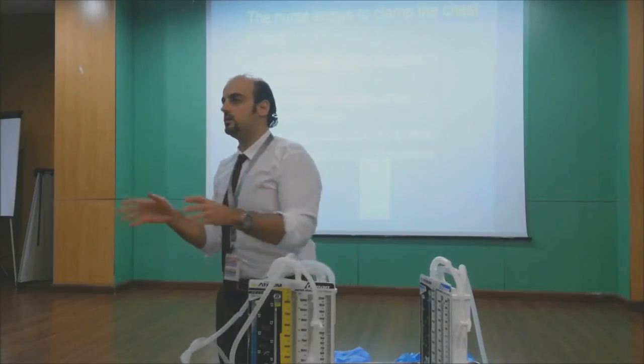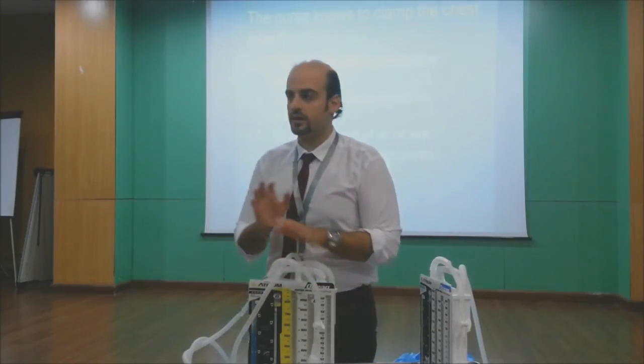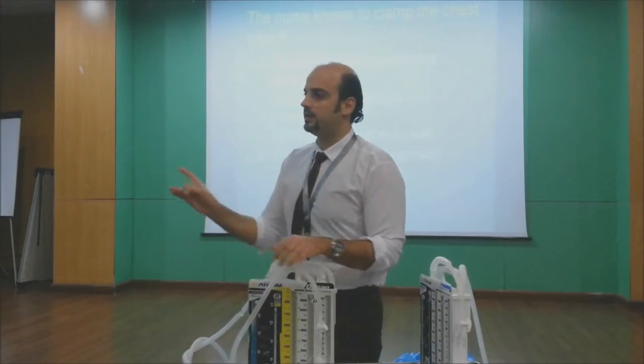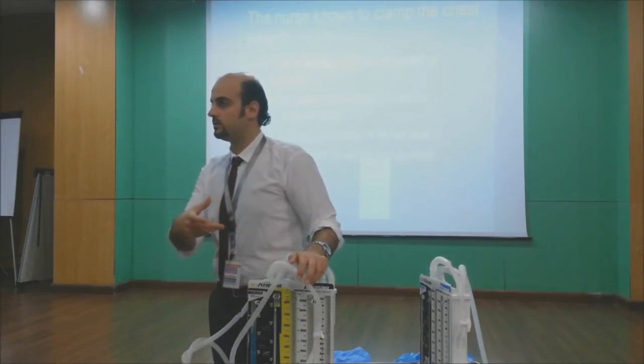If you stick to our instruction, to what we say here, and just see a bubble, it will not finish. It will finish when you see a bubble like this. Okay, you can put another one. My question is not complete.